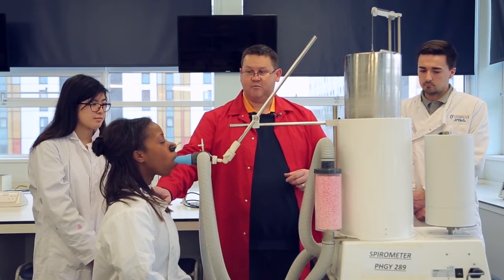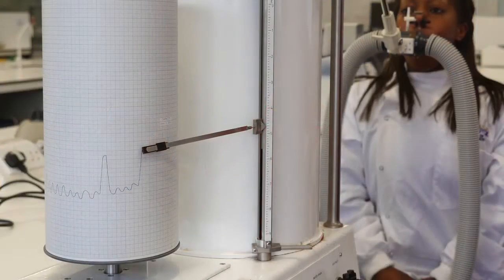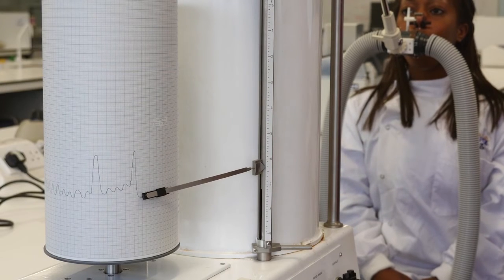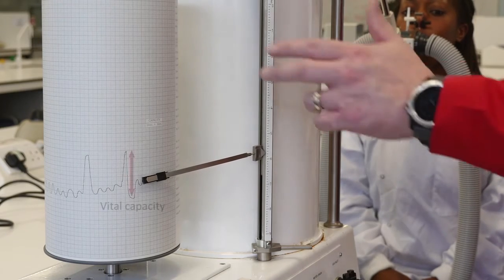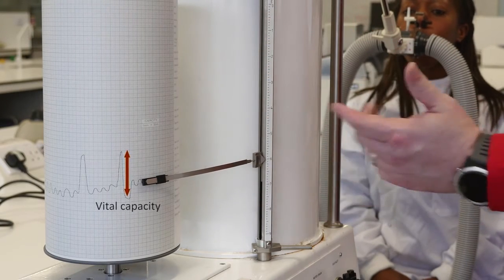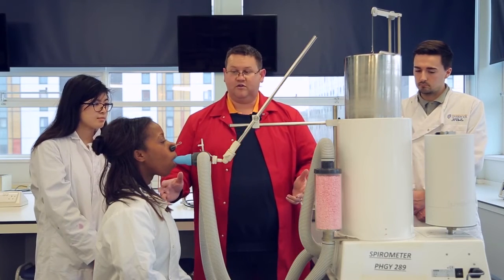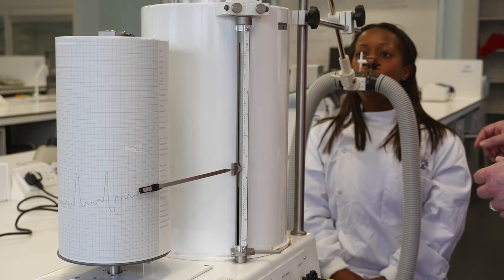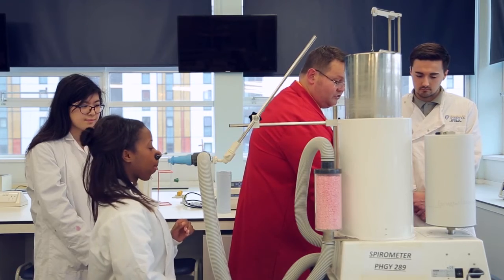Now if you can do the same but giving your maximum exhalation — okay, and then go back to normal breathing. What that one's now giving us is your maximum in and out ventilation, so it gives us the vital capacity. Okay, and then just keep breathing normally. Thank you very much — I'll put you back onto the atmosphere and then I can stop the drum.